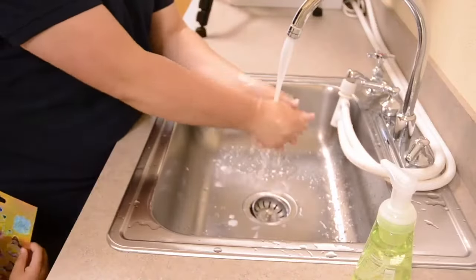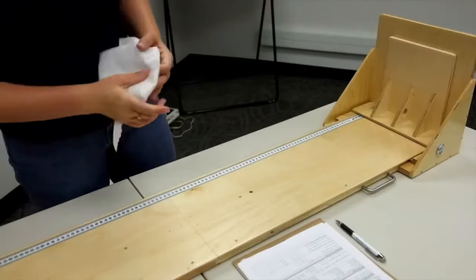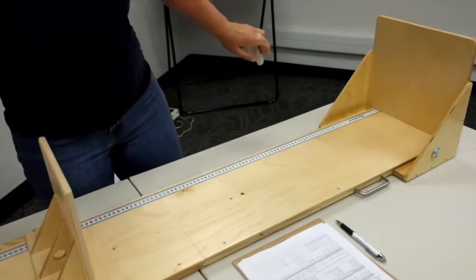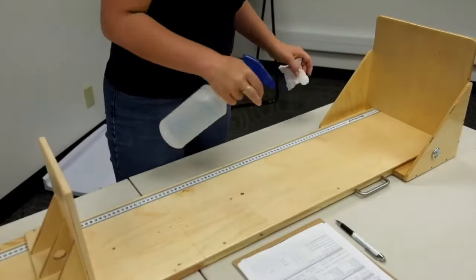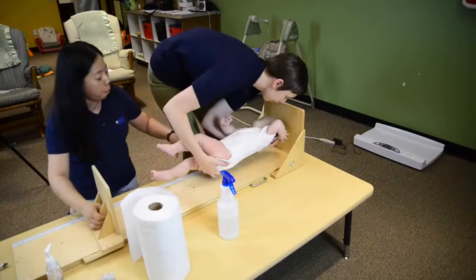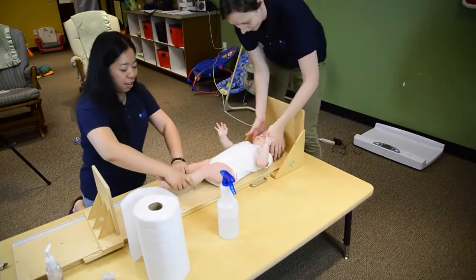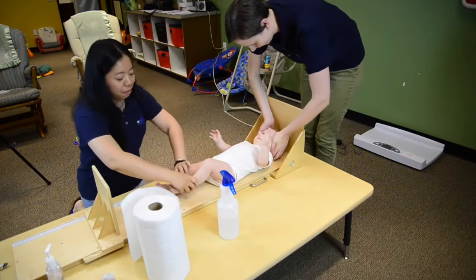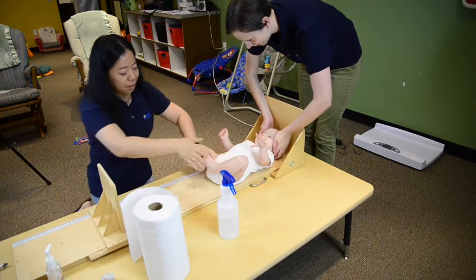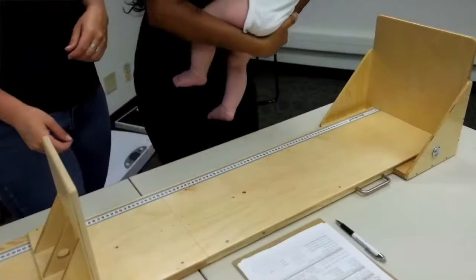The person measuring the child must first wash their hands. It is important to sanitize all measurement equipment before screening a child, between screenings, and after you have completed all screenings for the day. Measuring height and length should be done swiftly but accurately. It requires two caregivers to measure a child. Before you begin, ensure that one caregiver is assigned to the role of assistant and the other to the role of lead.